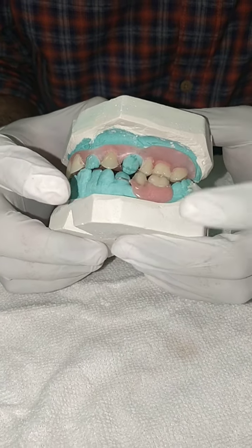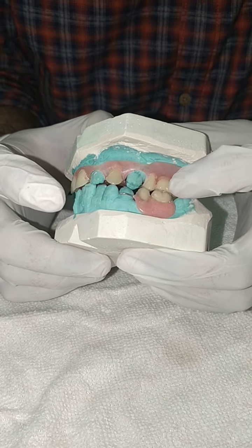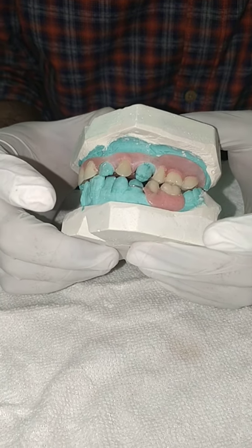This is a flexible partial and a lower acrylic nesbit bridge for patient Quashundra Williams. This is an upper flexible partial and a lower two-unit nesbit bridge. The patient has both posterior and anterior teeth missing on the upper — anterior missing and posterior missing on both the right and left sides.